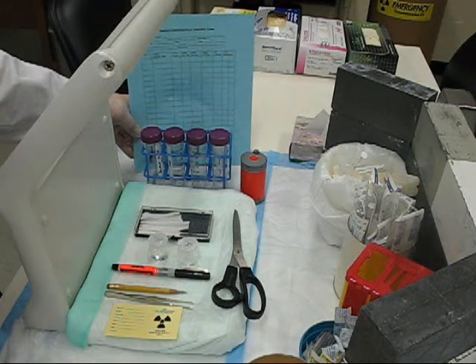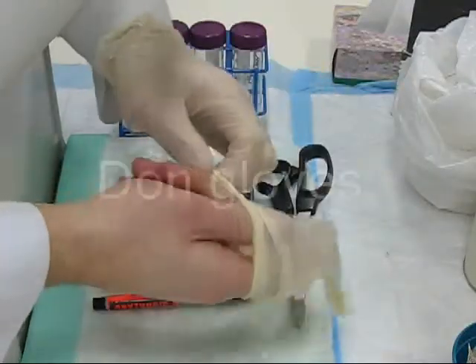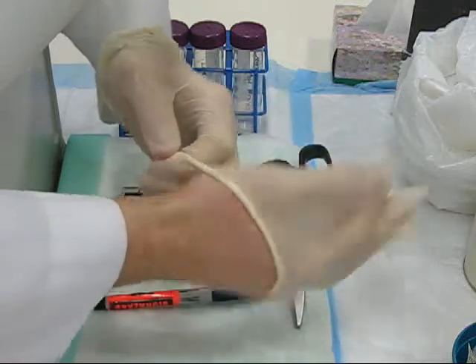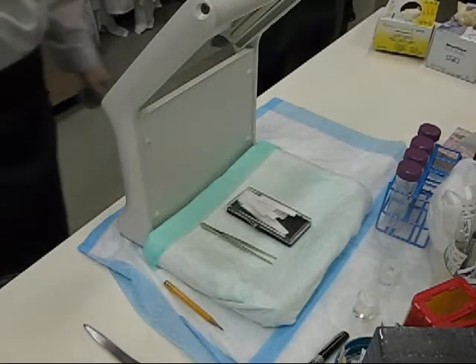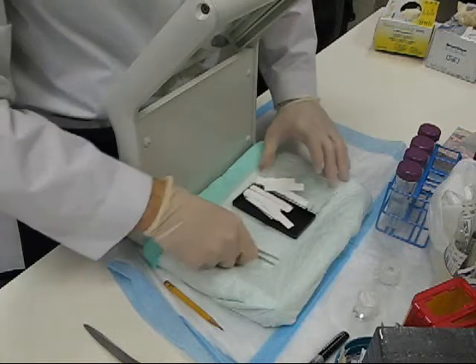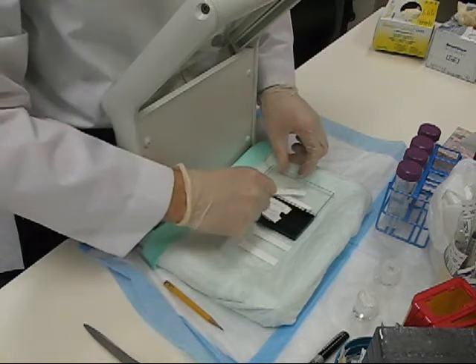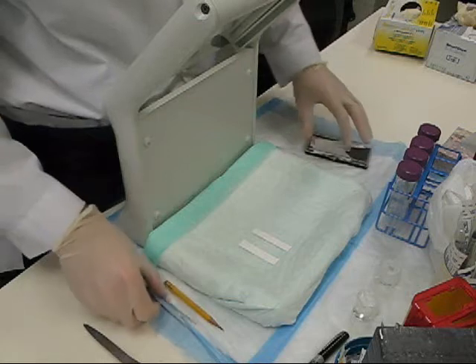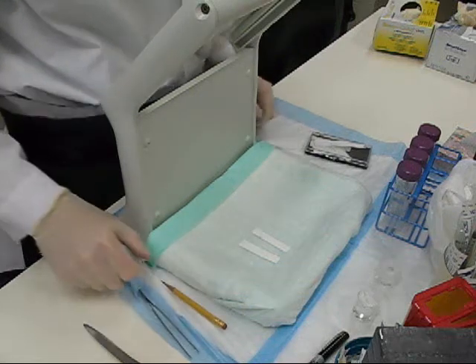Be sure to gather all the correct equipment at the beginning. When you're marking your origin, you want to be sure to mark the origin at least above the fluid level of your mobile phase.